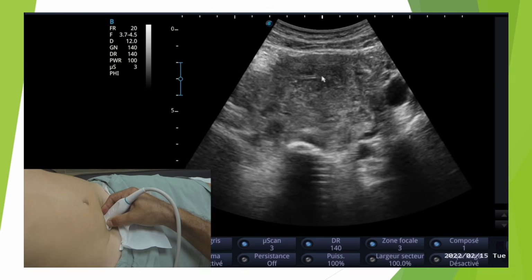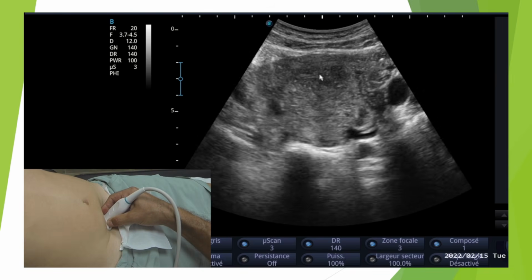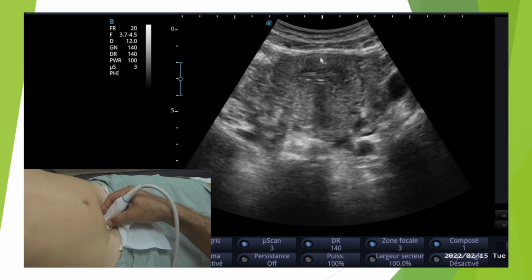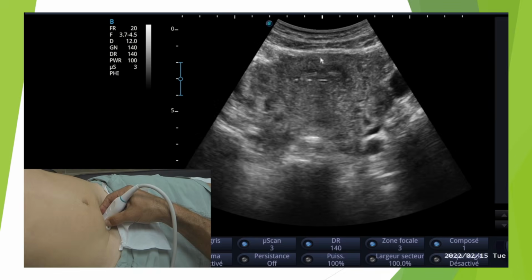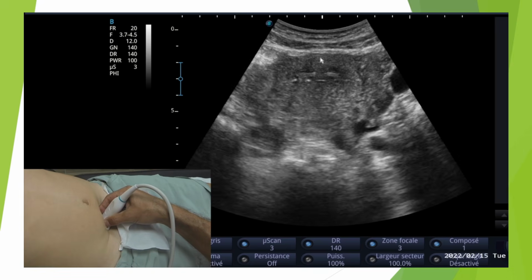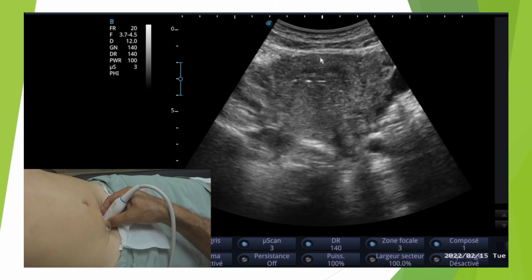And so you can do this if you want. You can take another measurement between the arms of the IUD and the fundus of the uterus, so also in the transverse view. You can see that we can still see it pretty well. Even though this is a hormonal IUD, so it's not the easiest type of IUD to visualize. If you compare it to pure copper IUDs, which are much easier to see, you can see that overall, it's still quite doable, pretty easy, and works well.